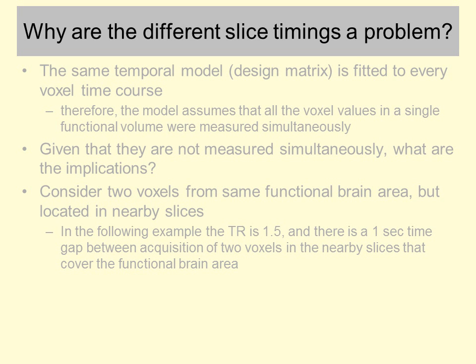So let's consider now why these different slice timings that could occur within the same brain region are a problem.